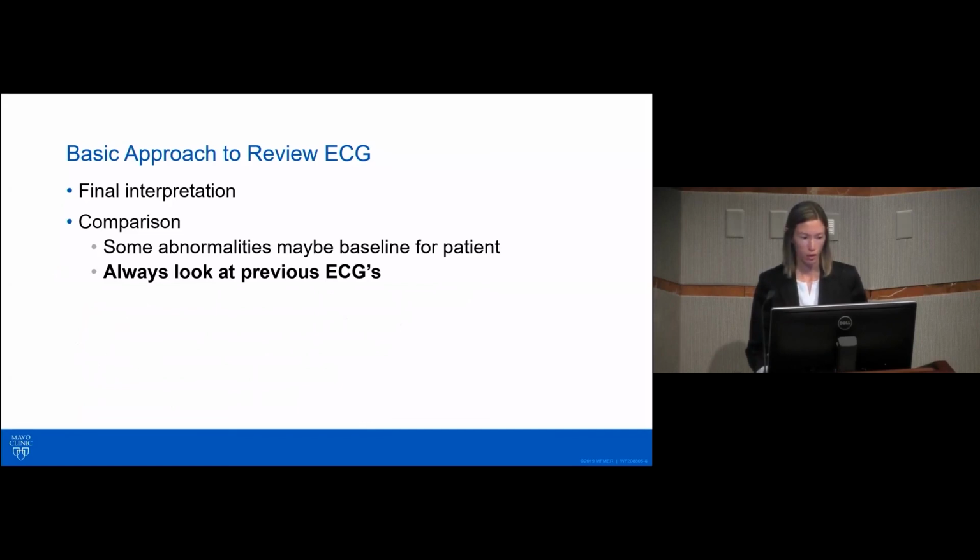And one caveat that I find really important is always look back at somebody's old ECGs. Some people live with some abnormalities that for them are normal and we don't need to be concerned about, but always compare to old ones if they're available.